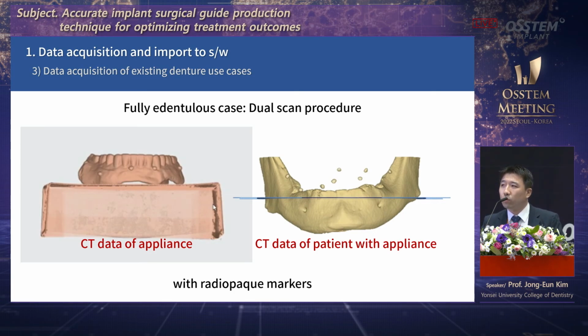In the case of fully edentulous patient, it's kind of a different story because the process of merging using tooth is not relevant here. Old denture the patient used or temporary denture needs to be fabricated to do merging and use it for merging.